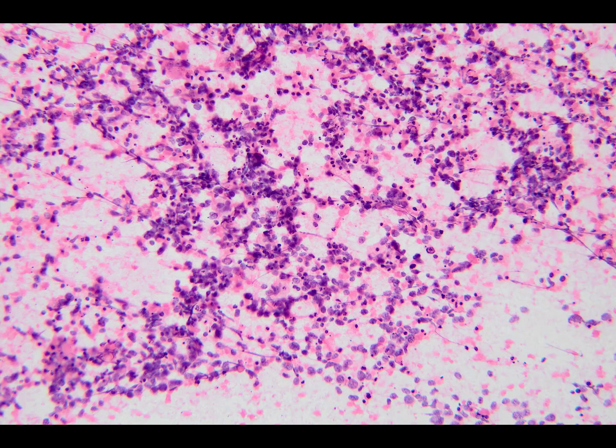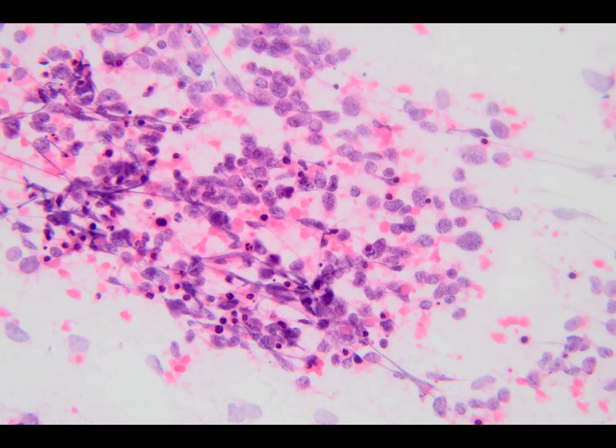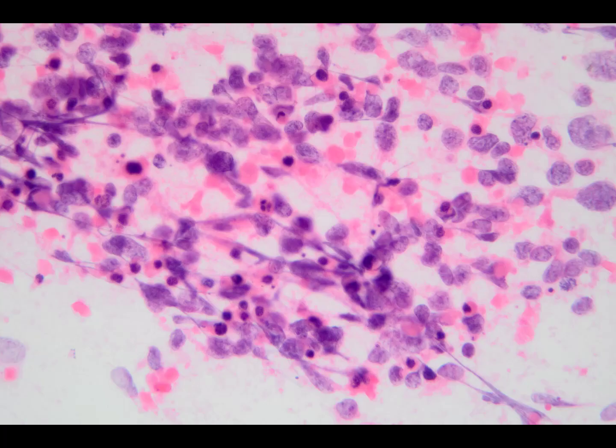This is a low-power view that shows a hypercellular population of lesional cells. A higher-power examination shows clusters of cells with scant cytoplasm and evidence of nuclear streaming. The tumor cells have ovoid to irregular nuclei, relatively even and coarse chromatin, frequent apoptotic bodies, and nuclear crush artifact. Cells that have more cytoplasm are less susceptible to nuclear crush artifact during the preparation of the smears. The presence of crushed nuclei is therefore a clue that we are dealing with a so-called blue cell tumor.